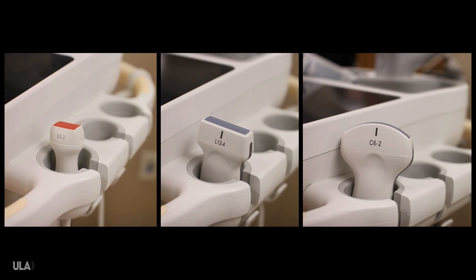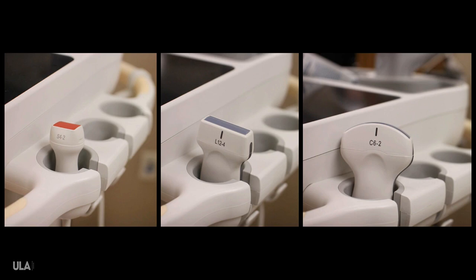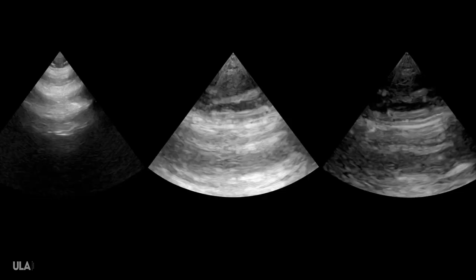Is it necessary to switch to the linear transducer? The answer is, well, sometimes. You can often see lung sliding just fine with the curvilinear or the phased array transducer.